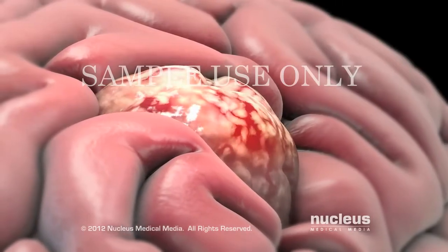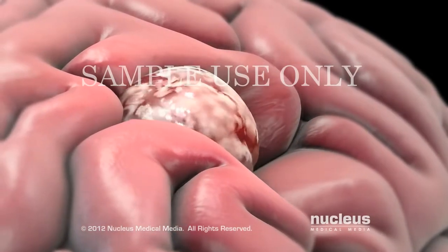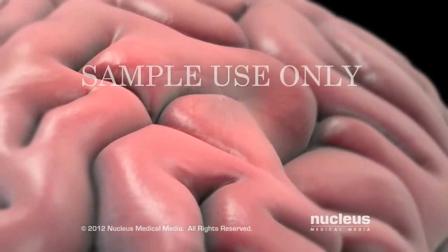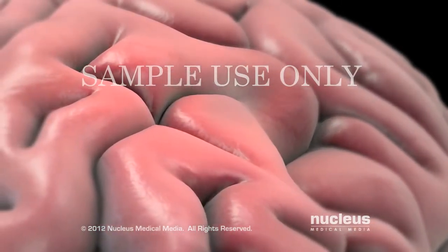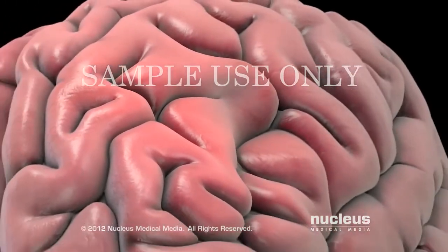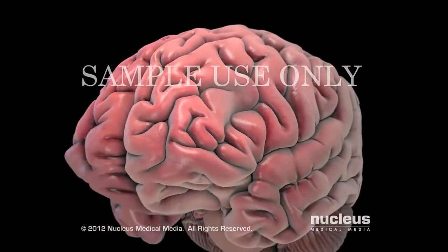You may receive many radiation treatments over days or weeks. This allows your body to recover between treatments and to kill as many cancer cells as possible.